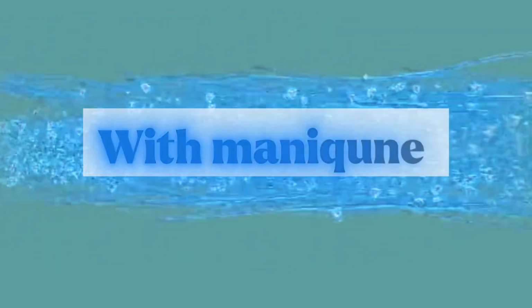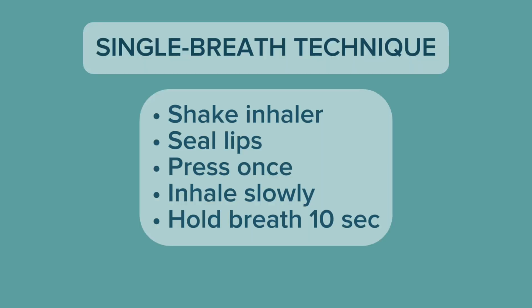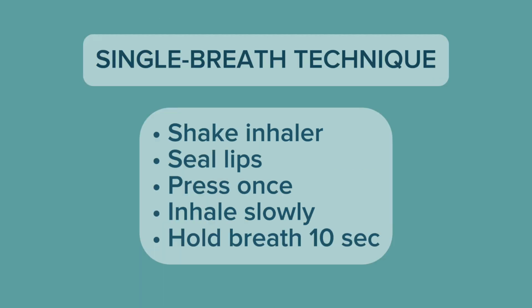In the exam centers, we have to do the procedure with the mannequin. So in this case, you have to use your hand to tilt the mannequin head back slightly. Okay, Patricia, could you please exhale? Now immediately grab the mouthpiece with your lips and teeth. Make sure to form a tight seal, okay?